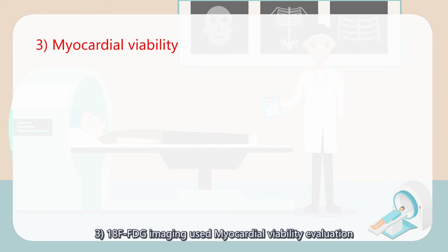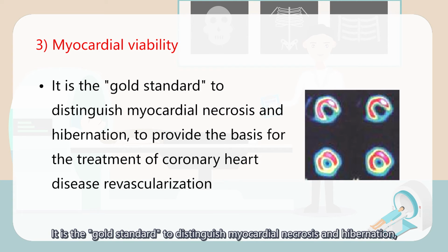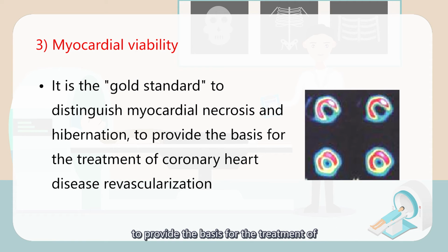And the third area of F18-FDG imaging is myocardial viability evaluation. It is a gold standard to distinguish myocardial necrosis and hibernation, to provide the basis for the treatment of coronary heart disease revascularization.